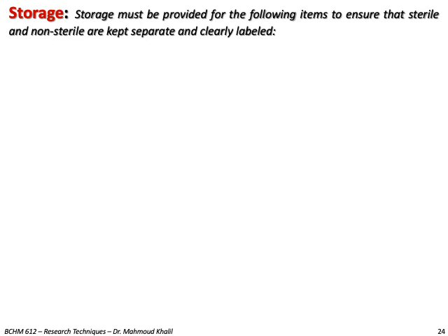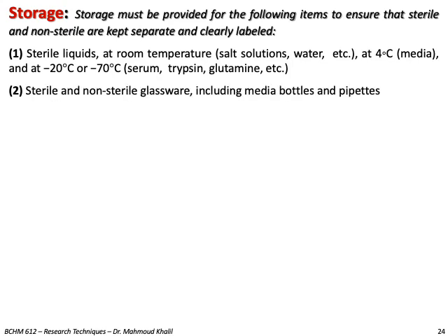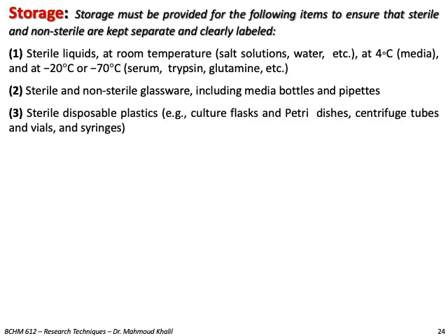Storage. So storage must be provided for the following items to ensure that the sterile and non-sterile are kept separate and clearly labeled. Storage must be provided for sterile liquids at room temperature, liquids like media at 4 degrees centigrade, serum, trypsin, glutamine, etc. at minus 20 and minus 70. As well for sterile and non-sterile glassware, including media bottles and pipettes.